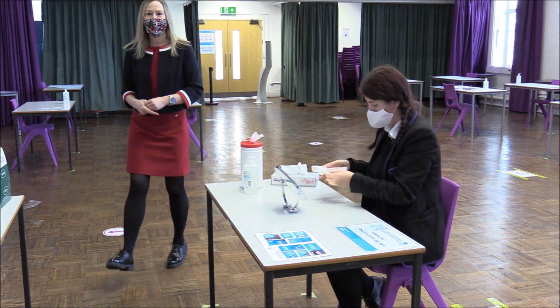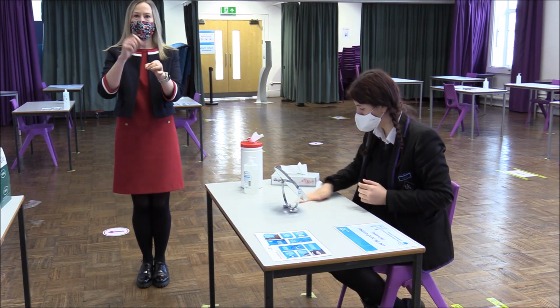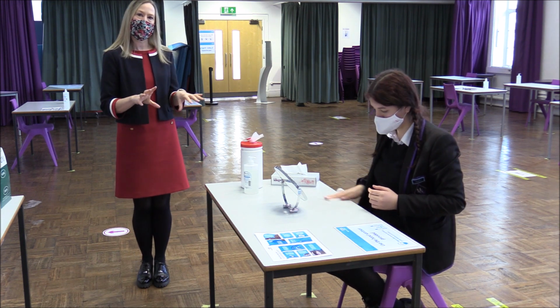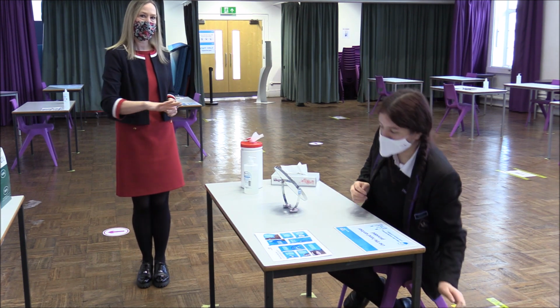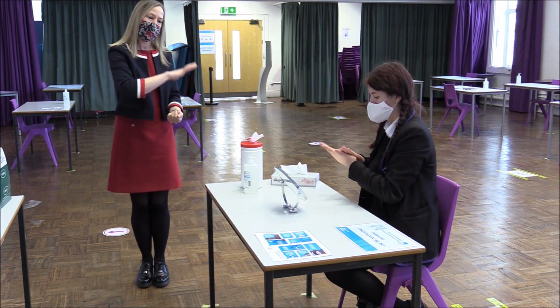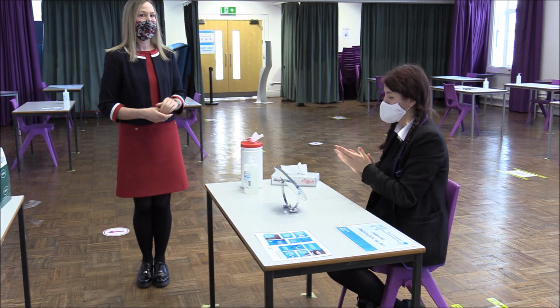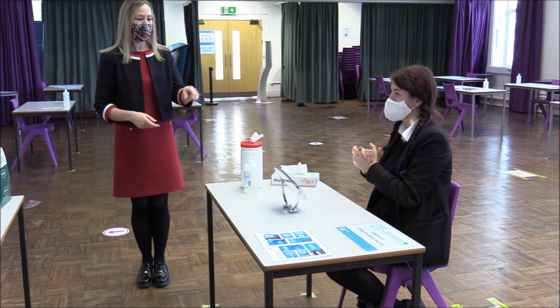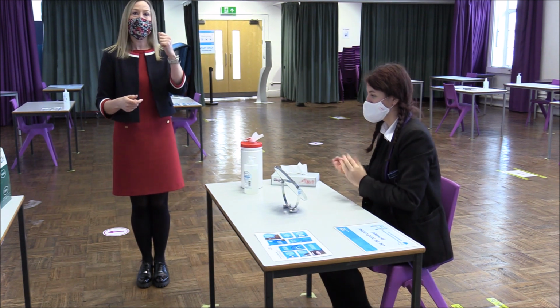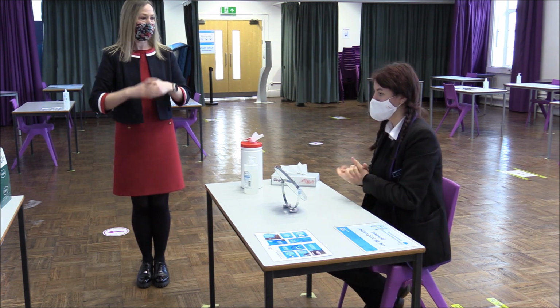So wonderful. So Isabel had to put her swab into a container with the testing fluid, which got taken away with the test operative, and then her last job is to make sure that everything gets clean for the next person. So you'll be asked to sanitise your hands, to clean the station, and to wipe down anything that you have touched. Now, because Isabel is an expert, she didn't need to touch the mirror, did she? But some of you might need to come in and hold up the mirror and use the mirror. If that is the case, you'll need to wipe that down too.